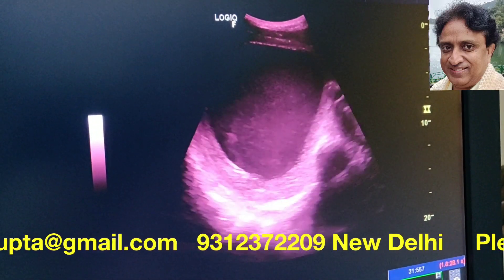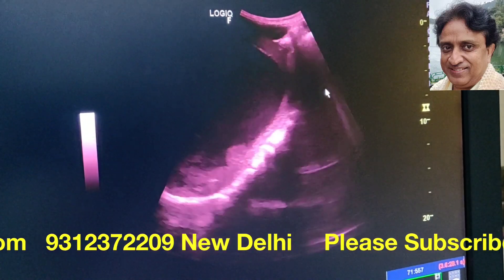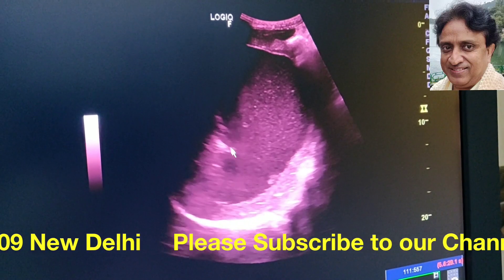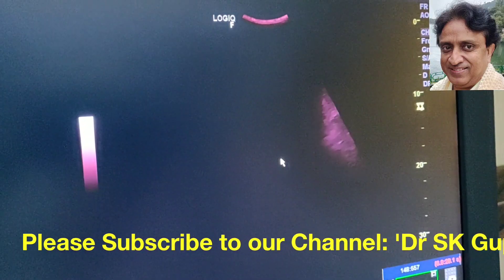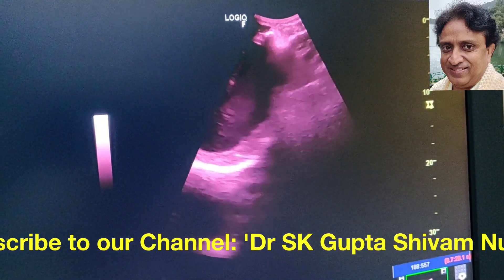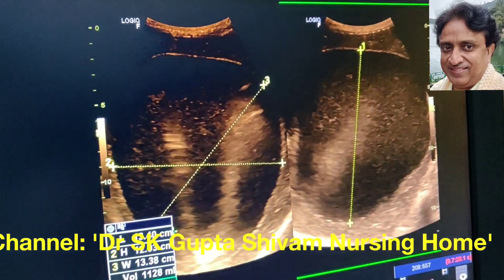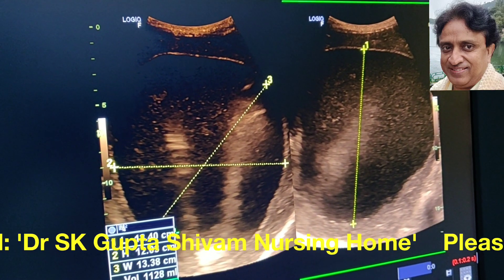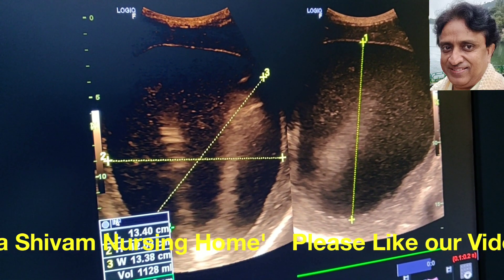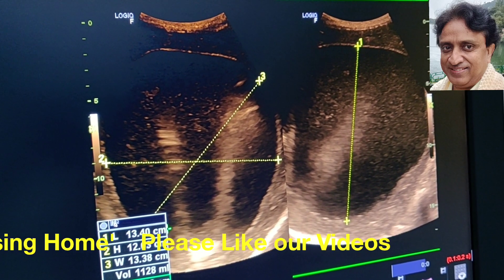This is the same patient with a large, partly liquefied liver abscess in the middle of treatment. The abscess has grown to a considerable size and requires major drainage.